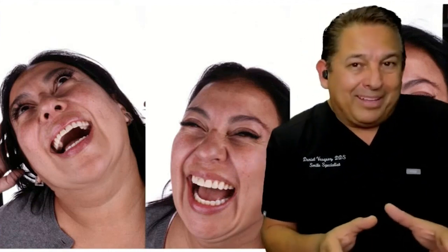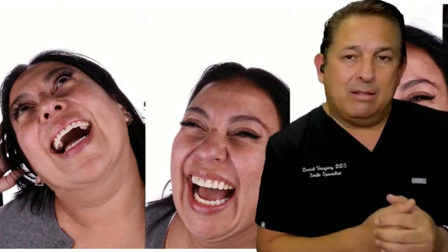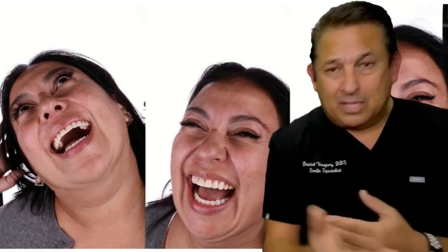It's like a Broadway play. Broadway play, you know the many hours that they spend back there training and getting everything ready? This is the same thing, taking impression, making the design, putting in the CBCT, merging everything, making sure everything is fine. That's the training. You're training, you're working, you're planning, you want to make sure that thing is going to be placed perfectly fine. So when that restoration comes in my office, from first molar to first molar, it's always going to have a temporary crown.